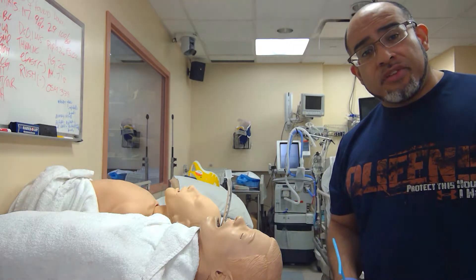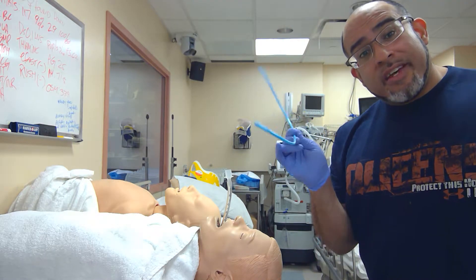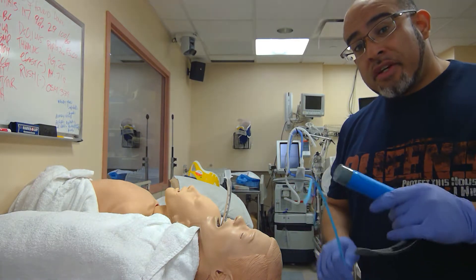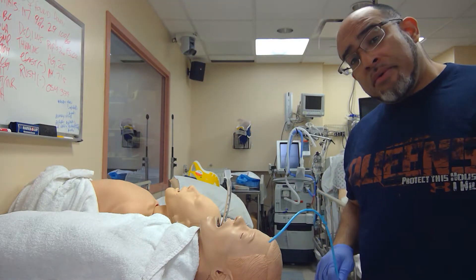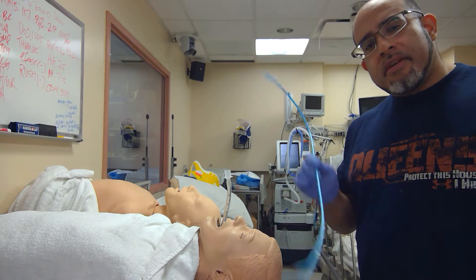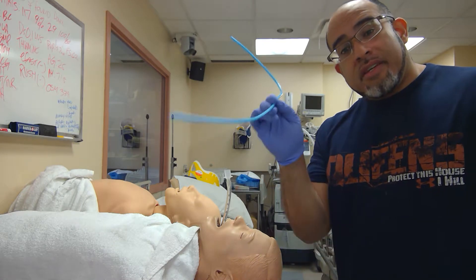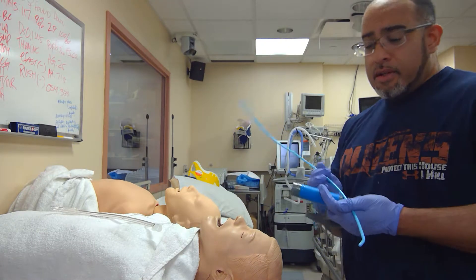It's a big fallacy — people try to predict difficult intubations. You can't. So get used to using this if you want to increase your percentages by 10%. Some of my residents are self-proclaimed masters of the GlideScope and they get all the tubes, but when you use the MAC blade they say they get the tube in all the time. They want to get good at the bougie. Do not give up on your first attempts and failures. Some of you are like, I have no control of the bougie.